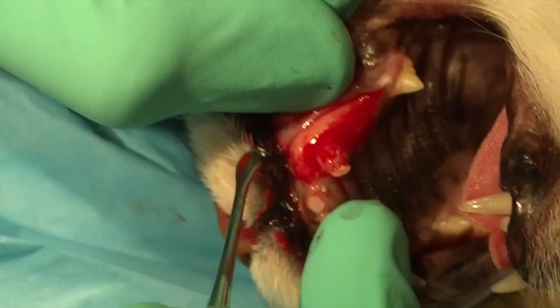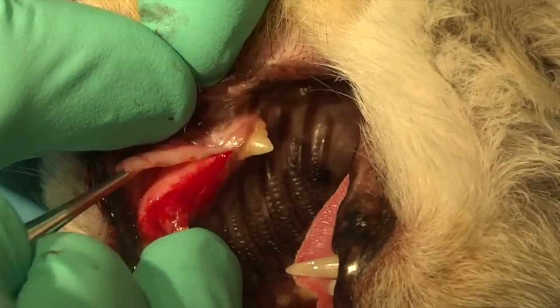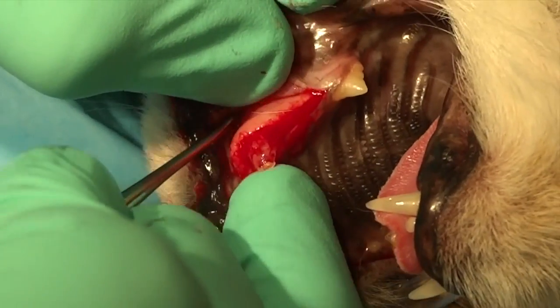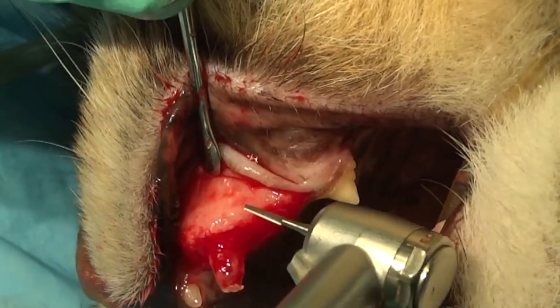So you see here, very quickly, we've got a nice flap started. Then we're going to come back with our larger end of this periosteal elevator, removing that unattached gingiva off of the bone.